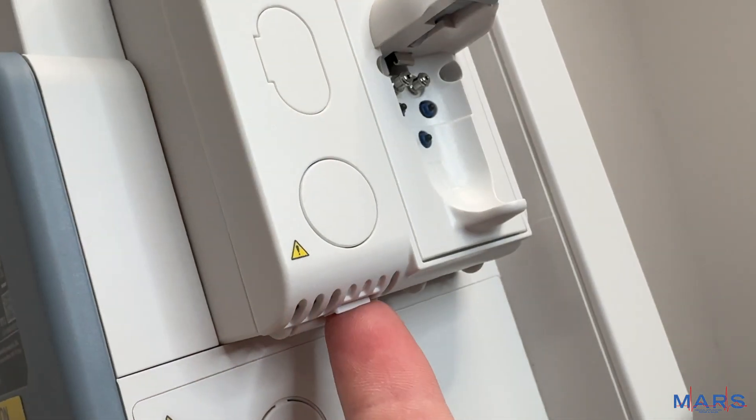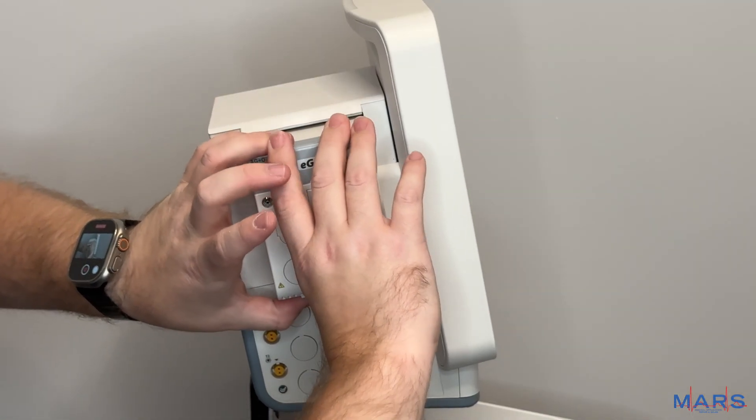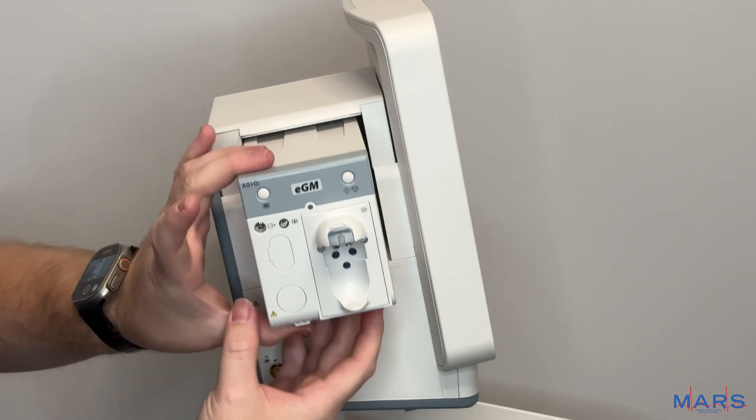You have to remember to undo the little clip and push down on both sides to slide the module out.